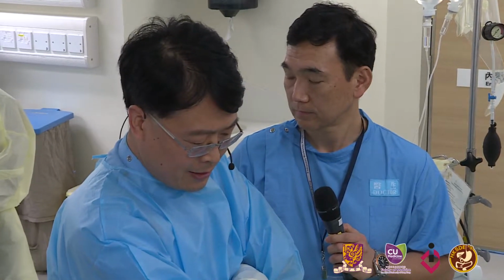Hold on, we have a question. What's the question? Yes, I'm Philip. So we don't have the full thickness device, and I think that lesion. Sorry, the sound is very poor. We cannot hear very well. Can you hear? Yeah.